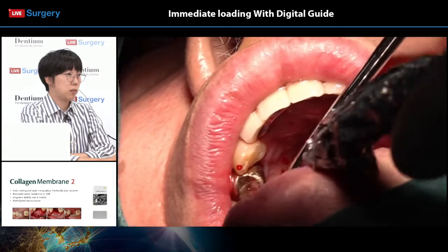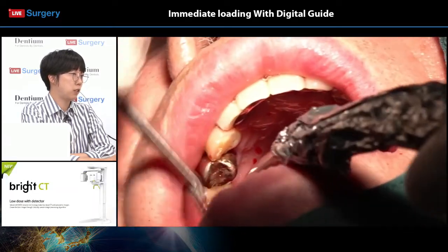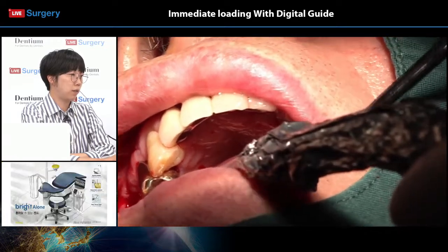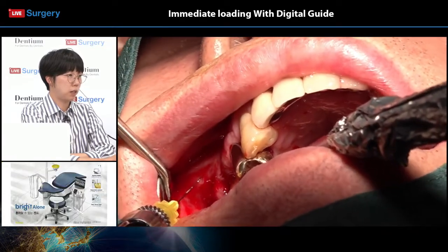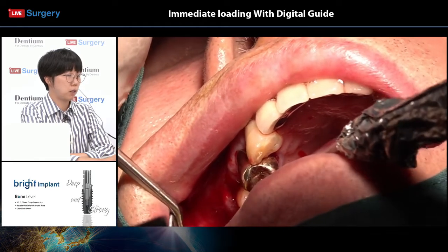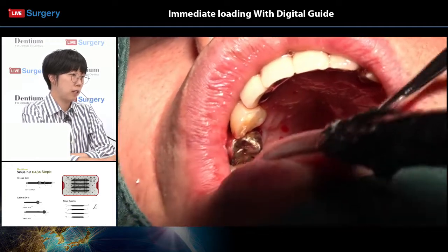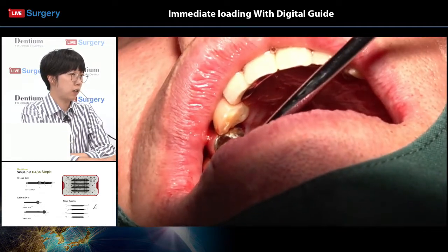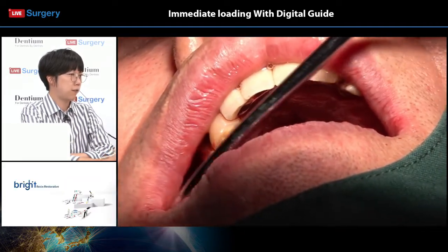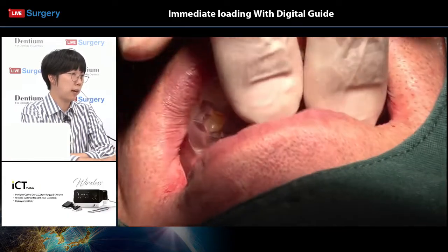From the surgeon's perspective, bleeding is what we really don't want because it's a hindrance, because it, first of all, blocks the surgeon's view. It makes everything go slower, and it's very hard to have a clean bone graft done when we have an extensive amount of bleeding because it just flushes everything away.